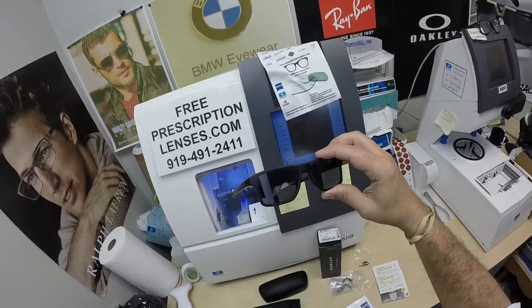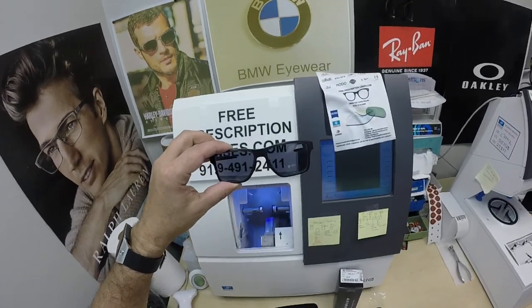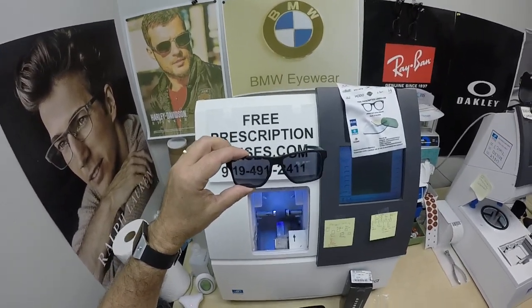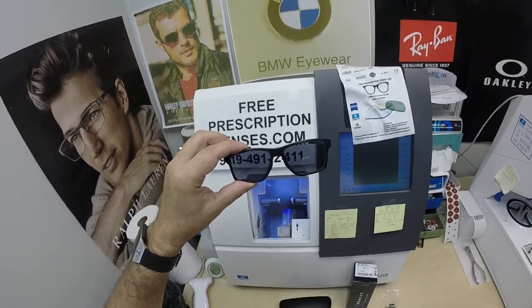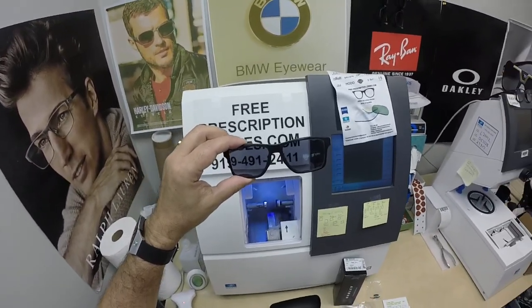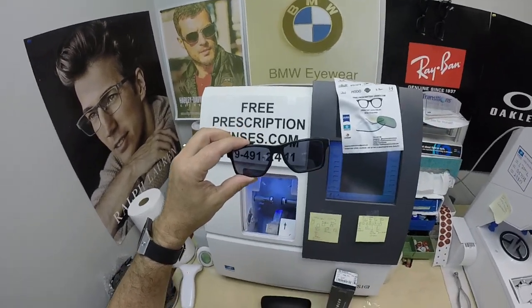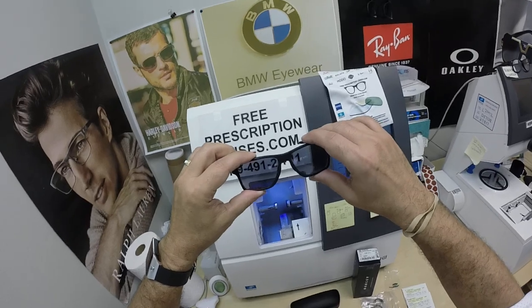The other nice thing about photochromic lenses: the Zeiss Gray, Brown, Green, or Blue — which adds $99 for those four colors — blocks 30 to 50% of the harmful blue light emitted from today's electronic devices. The Photofusion Extra Gray, which adds $129, blocks 50 to 70% of harmful blue light.